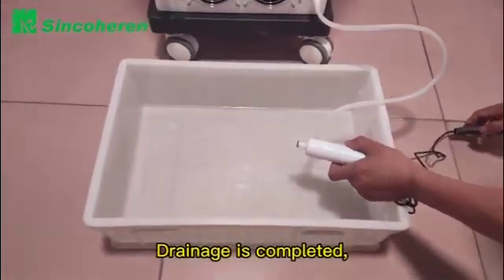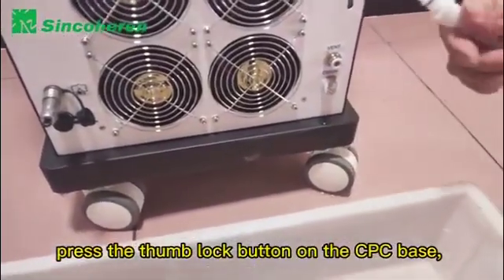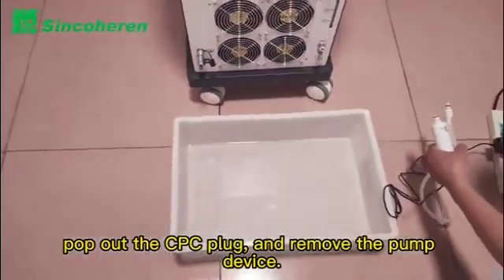Drainage is completed. Turn off the power switch, press the thumb lock button on the CPC base to pop out the CPC plug, and remove the pump device.